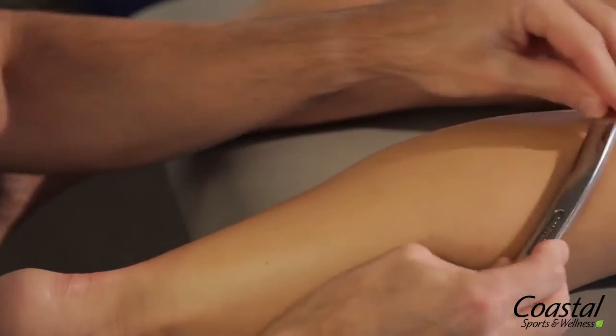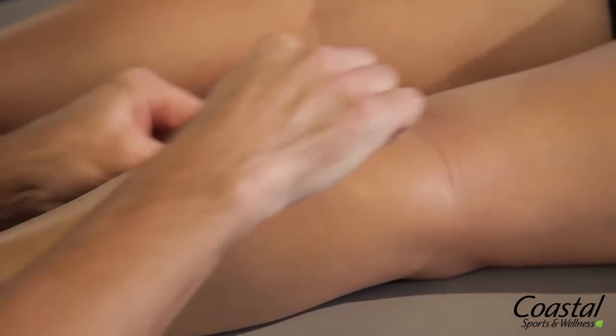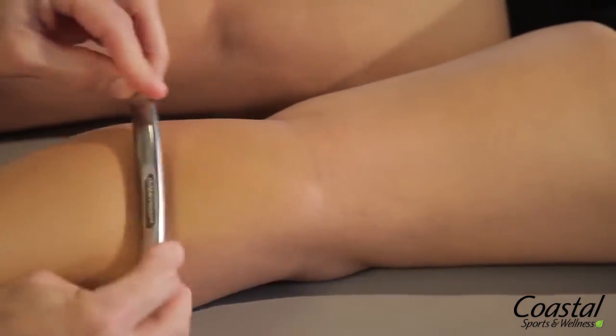To help with pain control, we can use it in a desensitizing approach, where we very lightly brush the tissue with the instrument, and we've found that's very effective at controlling pain or desensitizing the area. You can also think that dysfunctional scar tissue itself can be a pain generator.